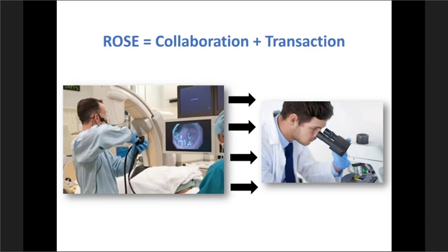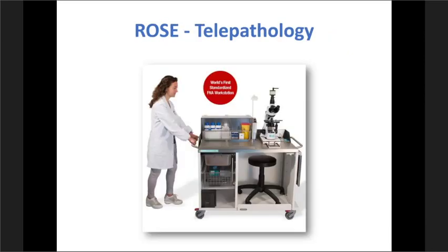So in that way, communication is the key. It is collaborative, it's transactional. So these are considerations we have to definitely keep in mind. In our practice, we introduced telepathology almost 2 years ago or so. We have a cart, which is actually a transportable cart, but our cart is actually stationed in the GI suite, which really eases up the process.